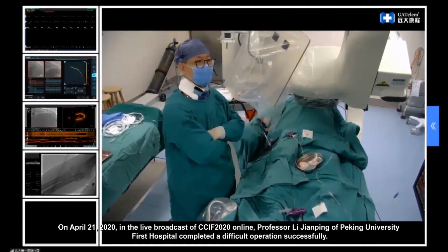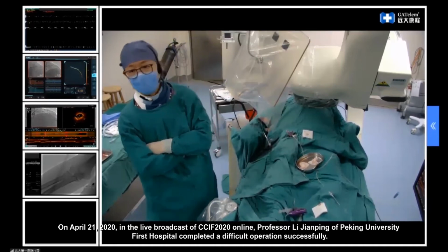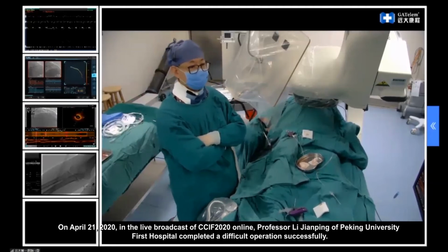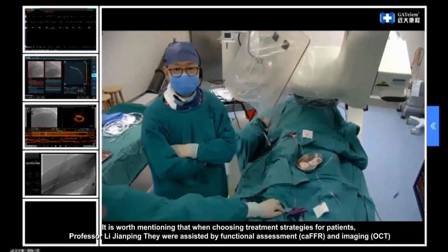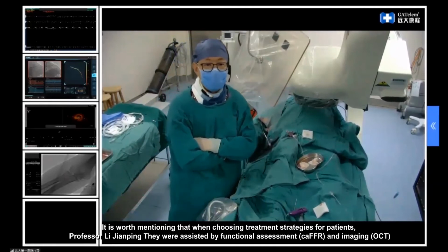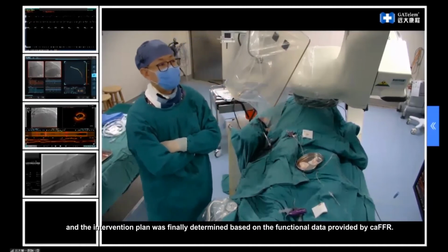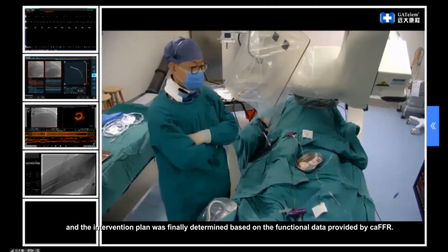On April 21, 2020, in the live broadcast of CCIF 2020 online, Professor Li Jianping of Peking University First Hospital completed a difficult operation successfully. It is worth mentioning that when choosing treatment strategies for patients, Professor Li Jianping was assisted by functional assessment (caFFR) and imaging (OCT). The intervention plan was finally determined based on the functional data provided by caFFR.